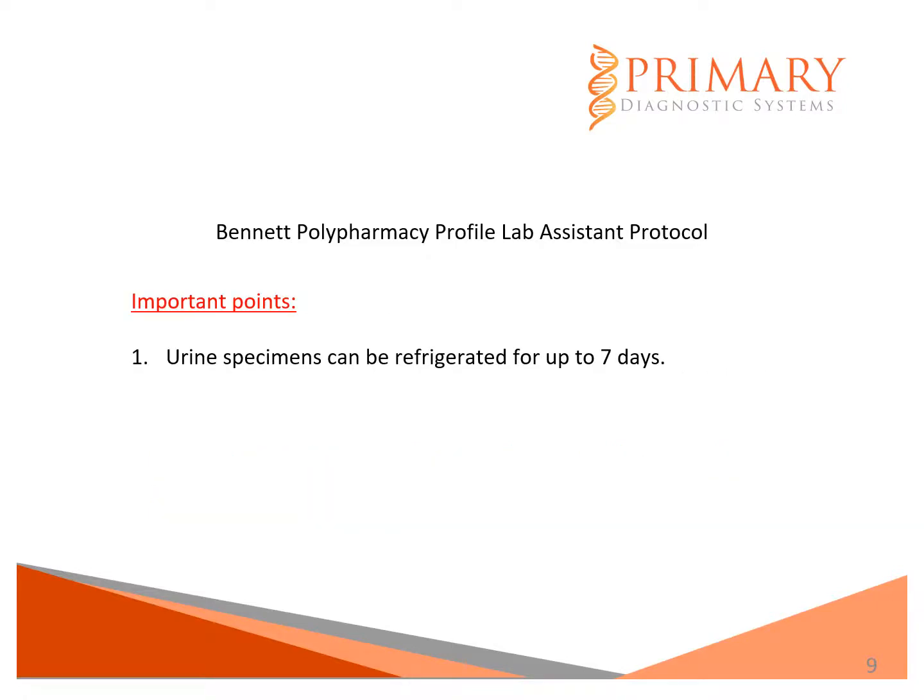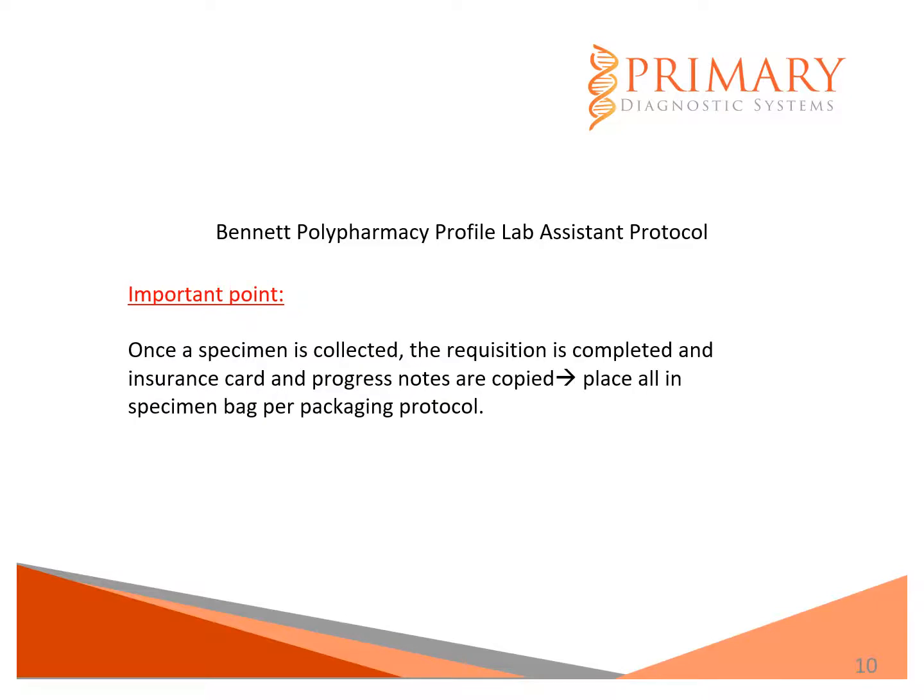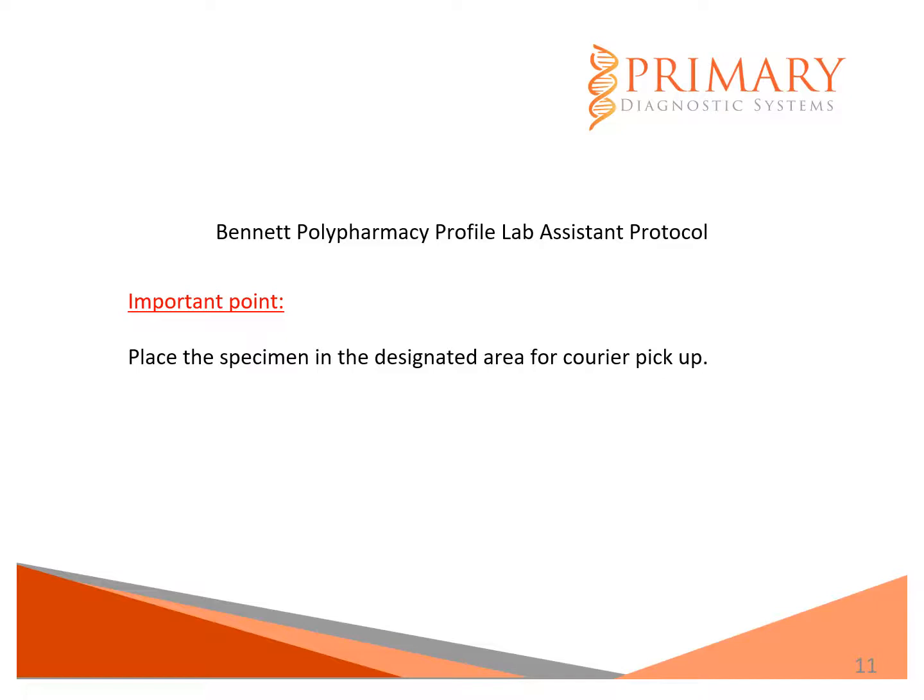One important point to remember for BPP specimens is that these urine specimens can be refrigerated for up to 7 days. Another important point to make is that once a specimen is collected and the requisition is completed and the insurance card and progress notes are copied, place all this paperwork in the specimen bag per your packaging protocol. After packaging, place the specimen in the designated area for courier pickup.